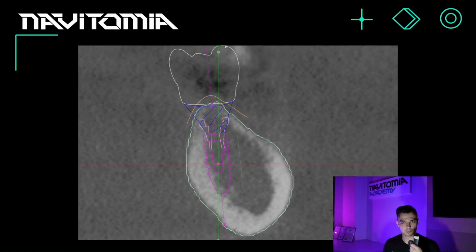It's all quite simple. Let's imagine that this is my implant, and the root, well, the implant itself, is longer than the superstructure and the crown itself. That's why during lateral movements, that is side-to-side movements, the lever here is much shorter. But let's imagine that this lever is actually very large. In fact, it's quite significant. And we can see that much less force is needed to shake up this whole system. That's why such a setup isn't exactly ideal, as you can see, on the one hand.